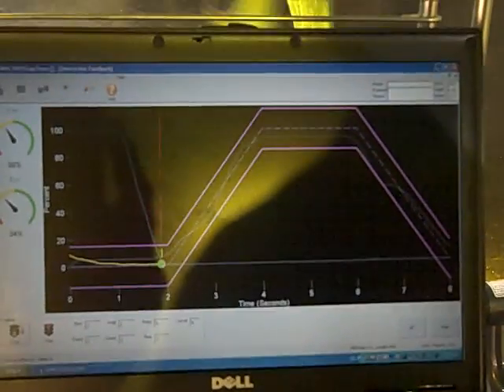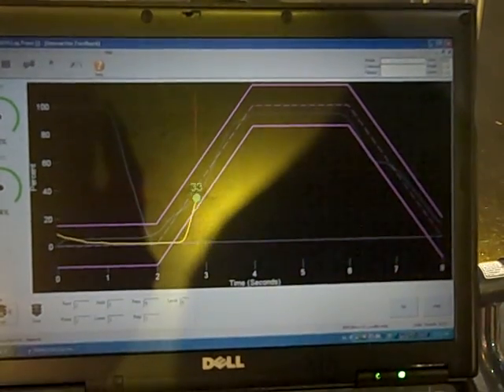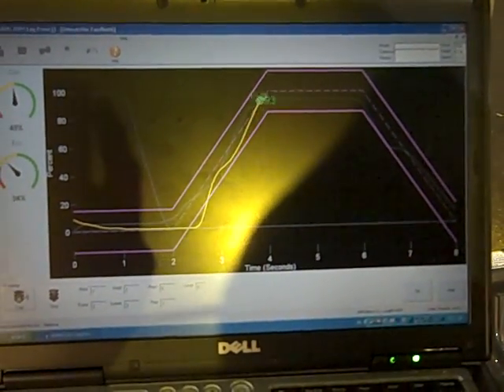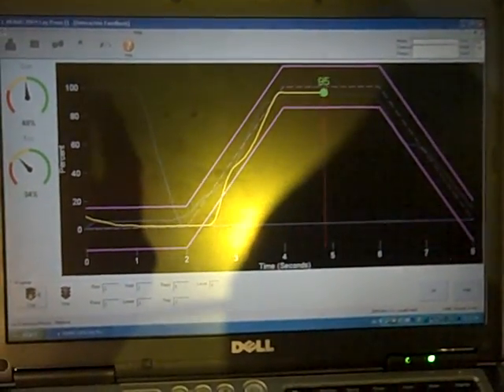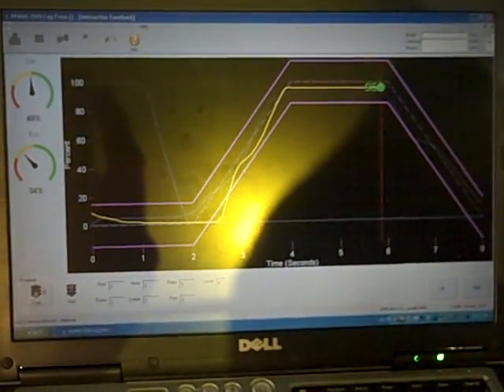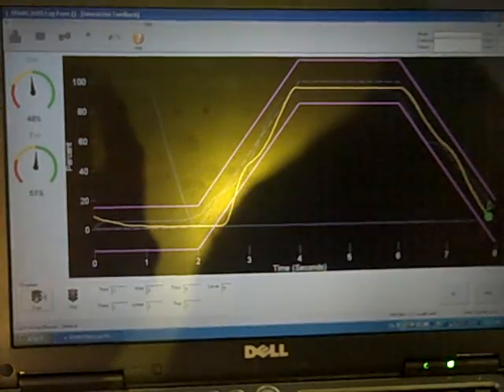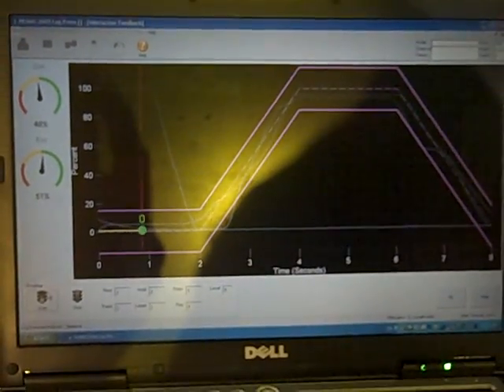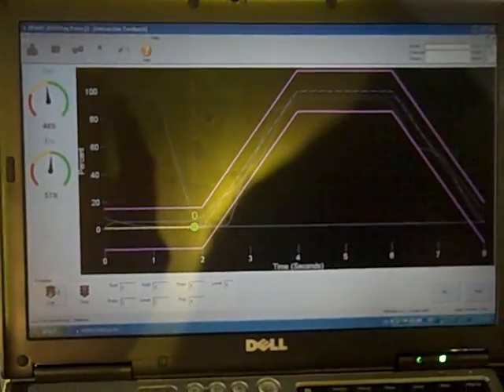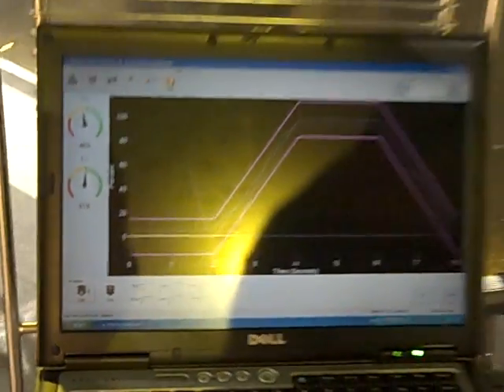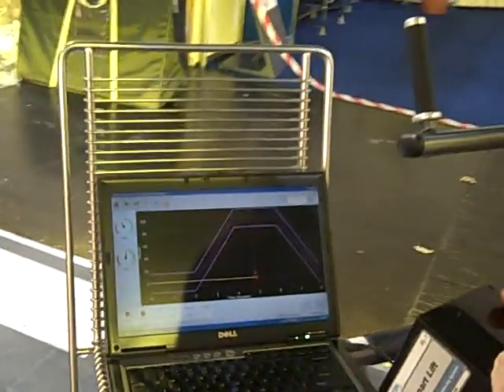It reduces the time it takes to teach a patient how to lift and shows them how to lift, while giving the clinician instant feedback on how the patient is performing. The program has a host of different displays based on the patient's needs.